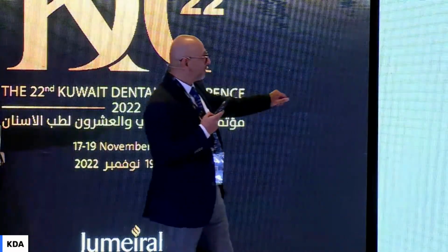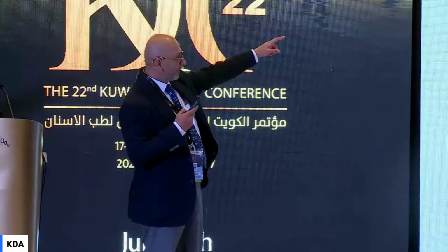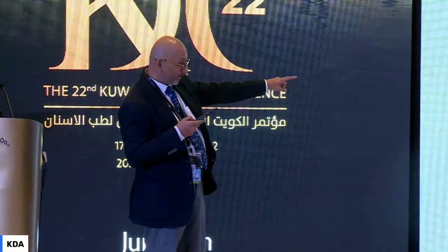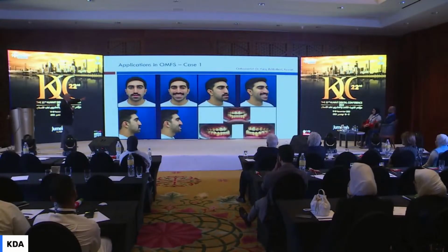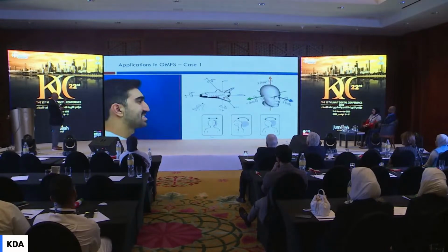So I had to do 3D planning for this case. So proper clinical photos, proper vertical natural head position photos. Look at the red line. This is very important for my planning, having a line on which I rely for the patient to look at their exact 3D position.